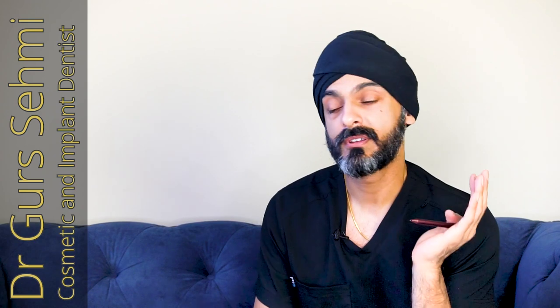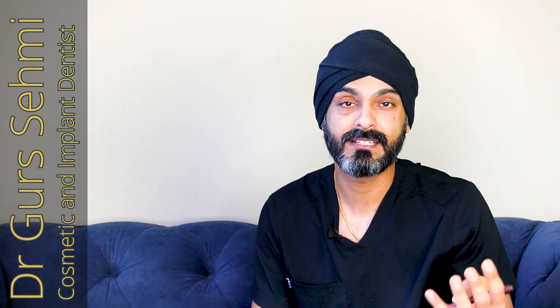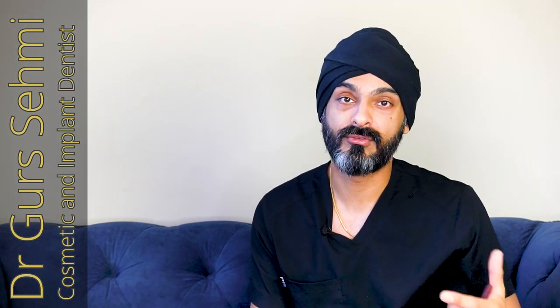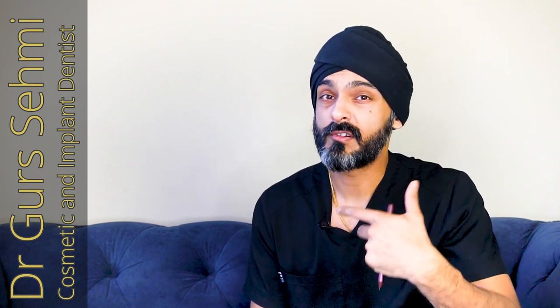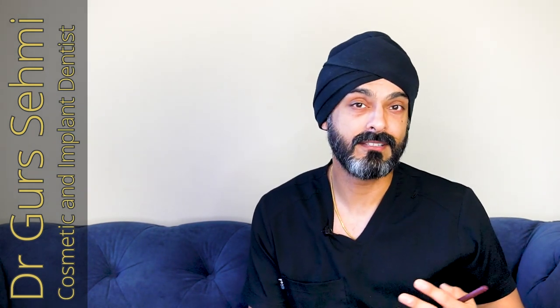In this video I'm going to show you what I explain to my patients when they've had dental implant treatment and how to keep it clean. We're going to talk about single unit dental implants, bridges which are sections of teeth on dental implants, and most importantly all-on-fours — because a lot of people understand that the success of their dental implant treatment depends on how well it's maintained.